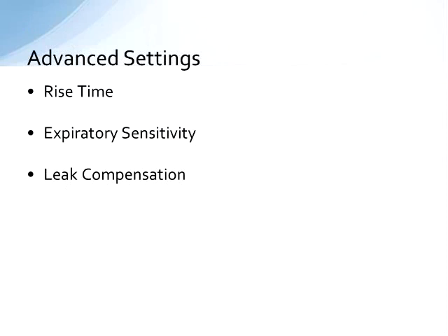So advanced settings. I just talked about rise time being that speed at which peak airway pressure, or inspiratory positive airway pressure, is achieved, and again is related to patient comfort and compliance. Expiratory sensitivity, E-sense, E-termination, lots of different words for this. It's a fancy way of saying when the breath ends, usually based on a percentage of peak flow or time. Again, non-invasive ventilation inherently has quite a few leaks, so you want to make sure that your expiratory sensitivity, when the breath is able to end, is set appropriately for your patient.